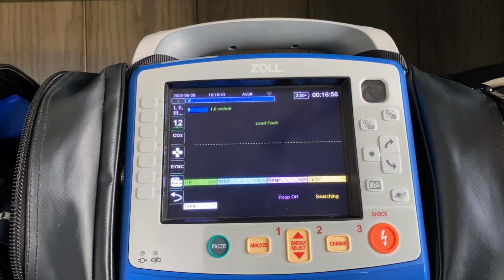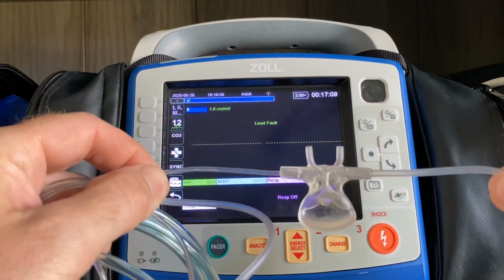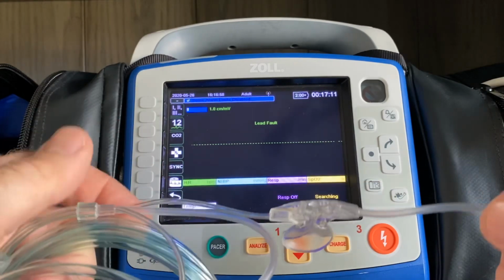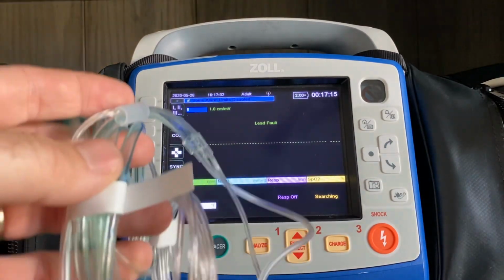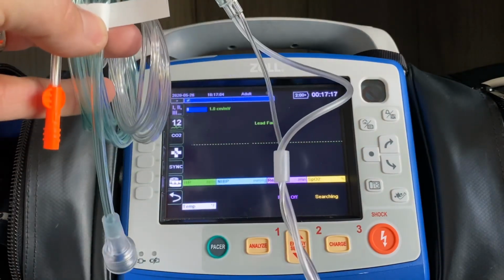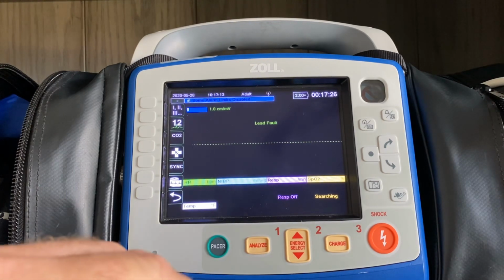All right, so the next thing we're going to take a look at is going to be the use of capnography on respiratory distress and sepsis patients. In that case, you're going to be using this disposable piece, this oral nasal cannula. The disposables that have supplemental oxygen will include this green tube set, which can be plugged into your oxygen port. When providing oxygen in that way, rather than just driving it into the patient's nostril, it's going to push the oxygen through these little pinholes.